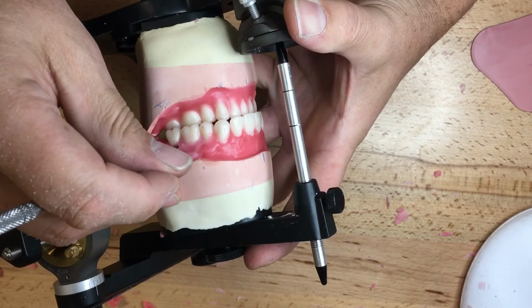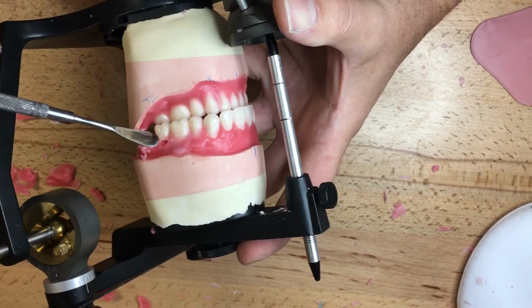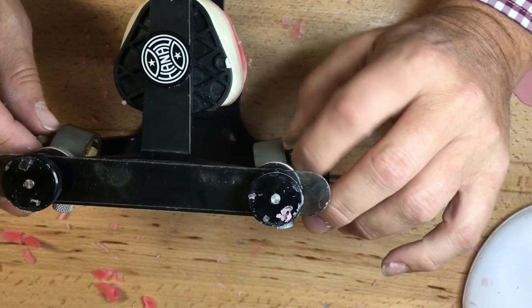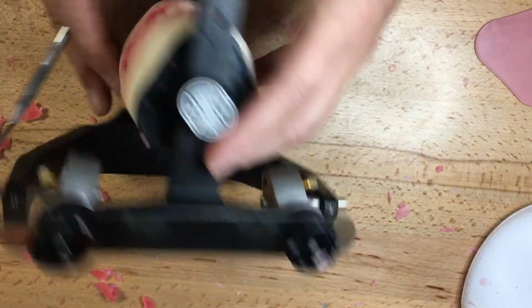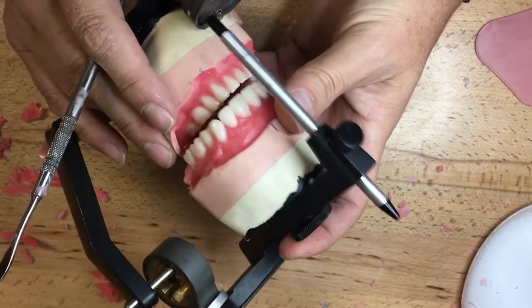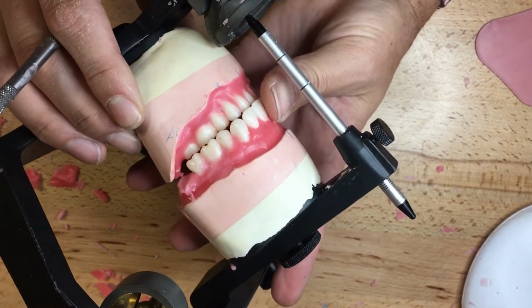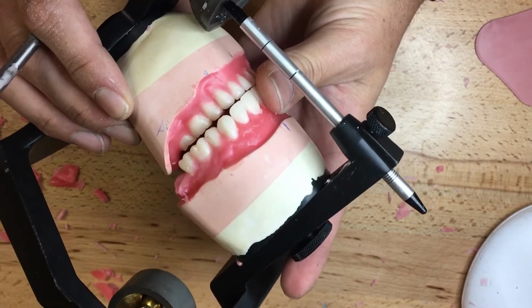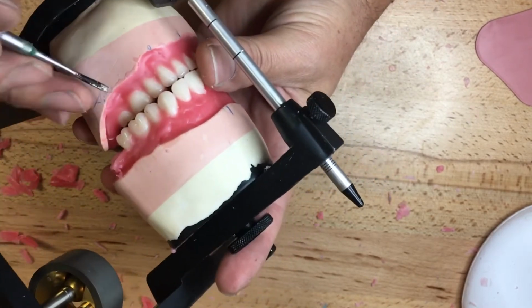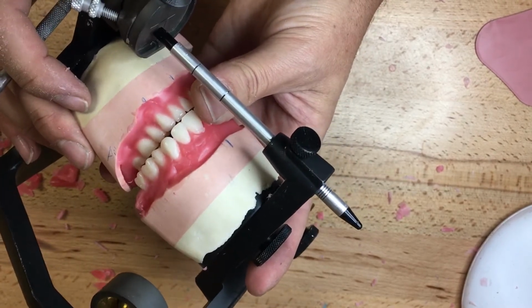Now, I only have half the setup done of the posterior section, but what I'd like to show you at this stage is if I was to put the articulator into an excursive movement without any contact of the other side, obviously, the lingual cusp rides up the buccal inclined planes of the lower teeth slowly, and I have balanced occlusion, except number 7 is open. Number 7 is open, and distal of 6 is open. How much? Dr. Gysi's amount. 0.5 millimeter, millimeter and a half. But I'm going to add that in later.